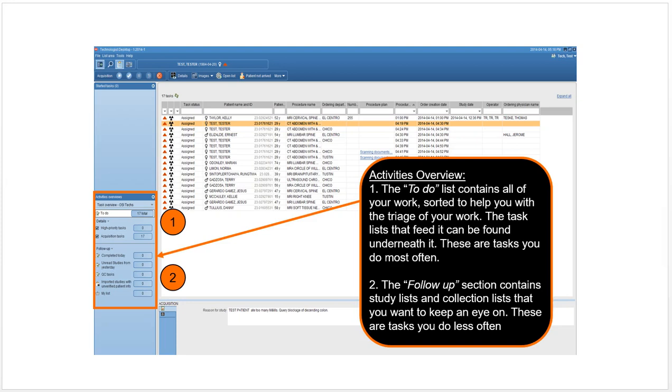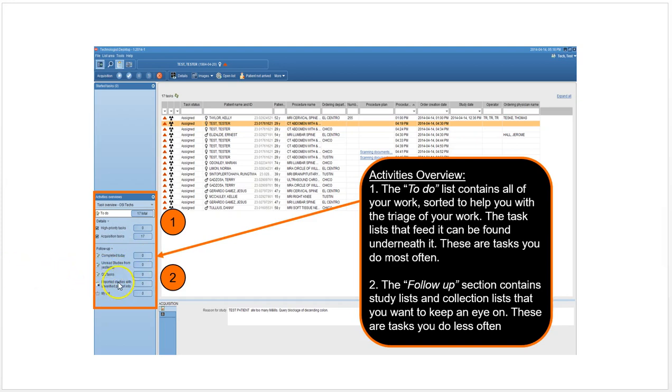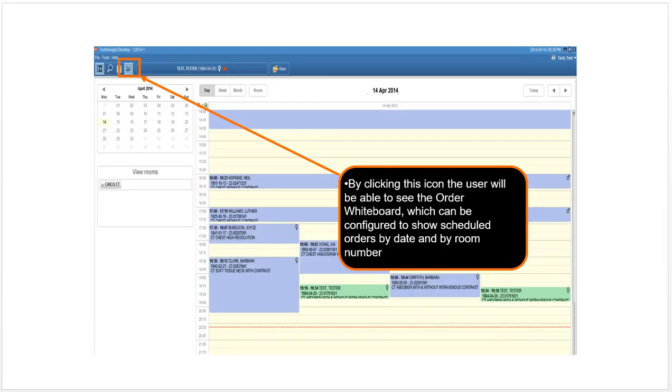This is the to-do section of the acquisition desktop role. Click on these different buttons and it will bring up the list of QC tests. Click that, you get the QC tasks list. Unread studies from yesterday, you click that, that's what you get. Click on the calendar, you can go to the calendar. You can view different rooms and see which rooms have different studies booked in them at what time.